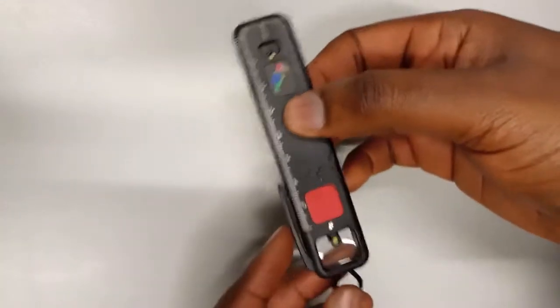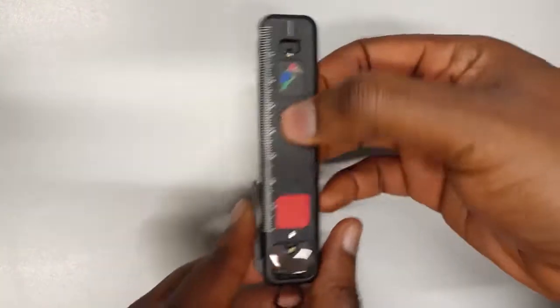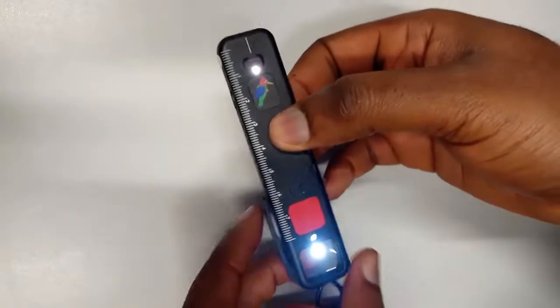This is the ArcLight. For the very first installment, when you turn the power switch on, both lights come on. So the first thing is to ensure that one light comes on at a time.